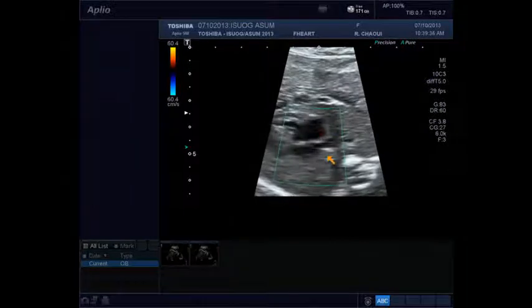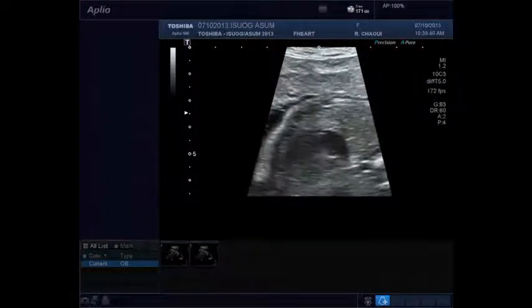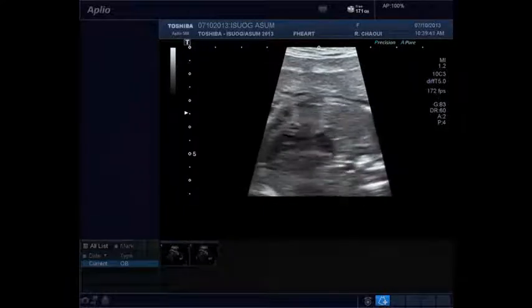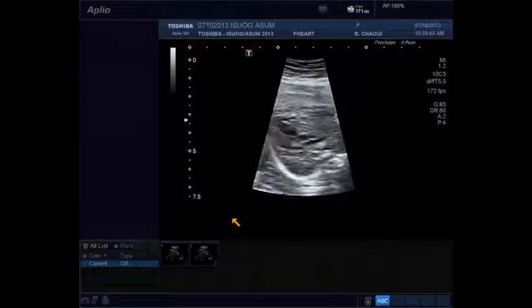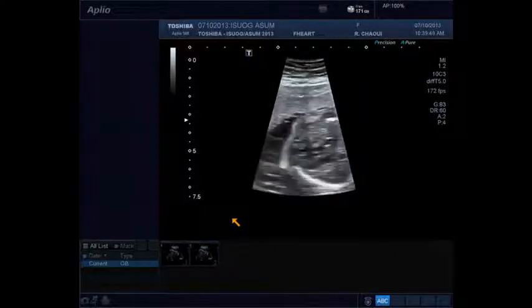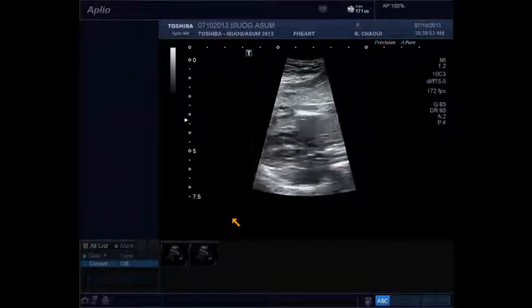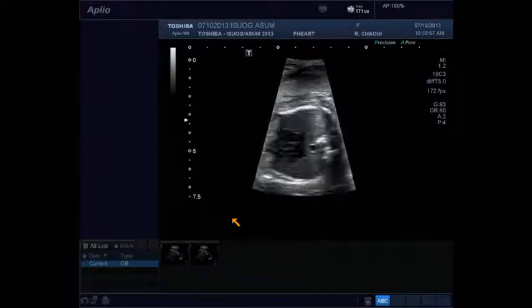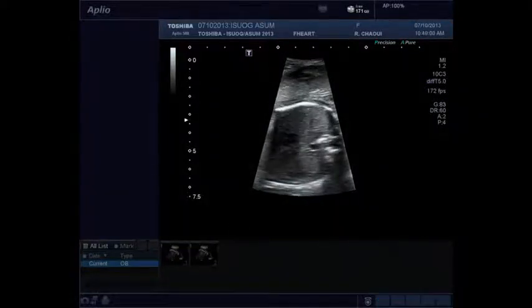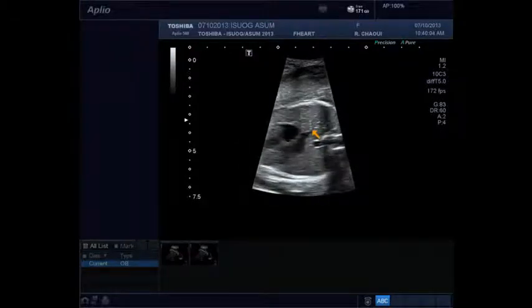Now, we occasionally want to make the picture smaller. Yeah. So if we want to see some more tiny vessels, such as the lung veins and the subclavian, what I do first is to try to see them on 2D, which is roughly for the right inferior vein in this region. I will add the dynamic flow.